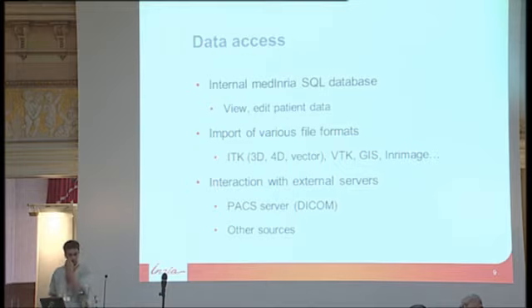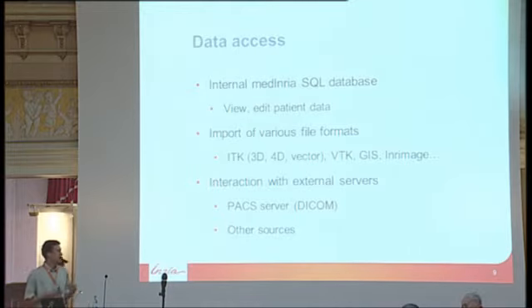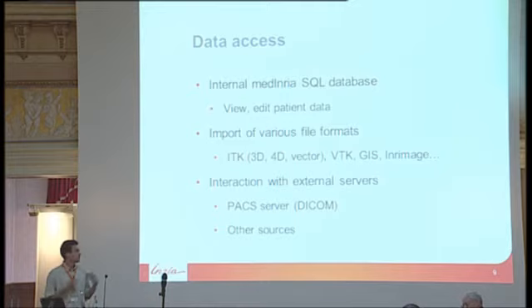And you can also interact with external servers. So you can interrogate a PACS server, meaning that we are able to import DICOM using DCMTK. And you can also interrogate other sources. We have right now Shanoir, which is a data management system developed at INRIA, but you could also develop a plugin to interrogate an XNAT server.